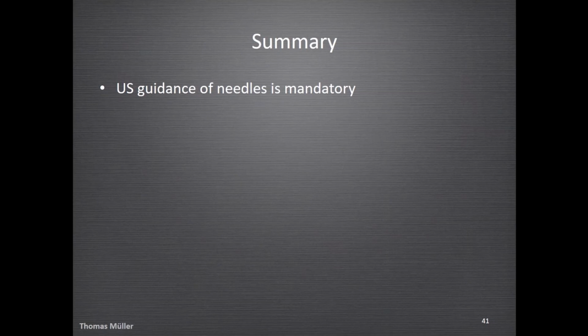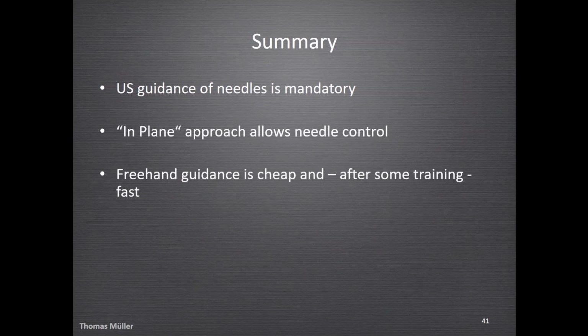Move your probe fan-wise very slowly and move the needle very slowly and try to get the whole needle on the image. This is the first thing you should do in the training. The in-plane approach, I was talking about it.